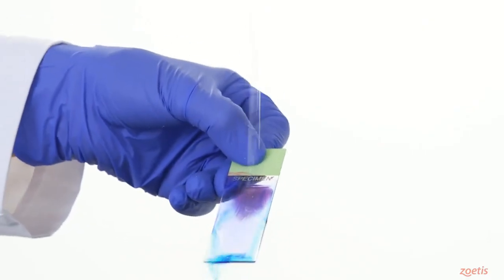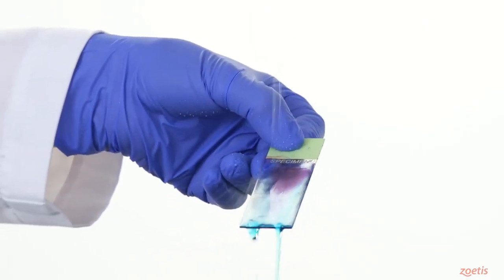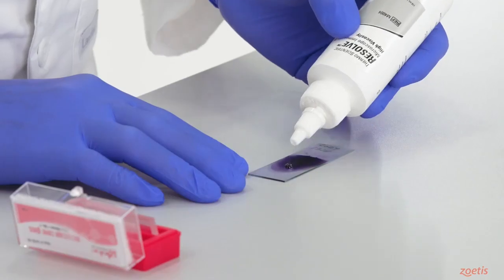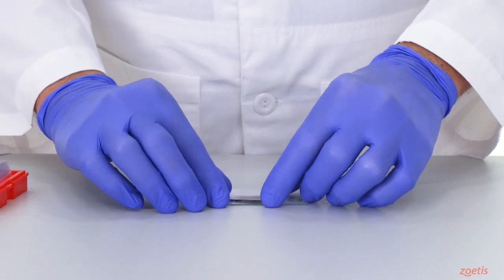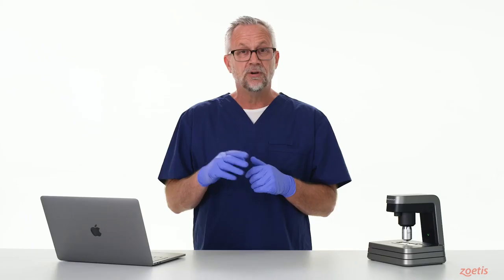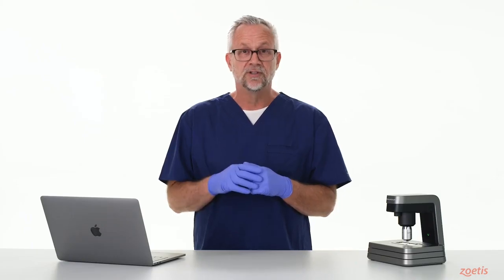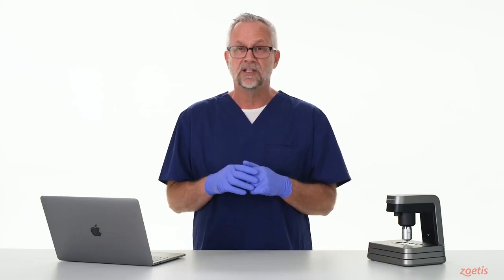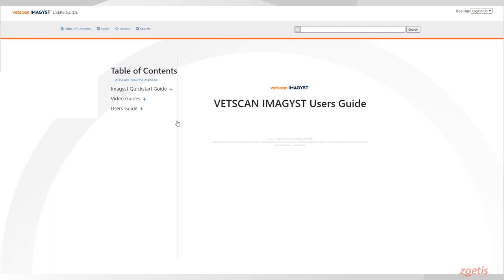Once the slide is prepped and stained, add a cover slip. Refer to our how-to videos on preparing a blood smear slide in the user's guide.